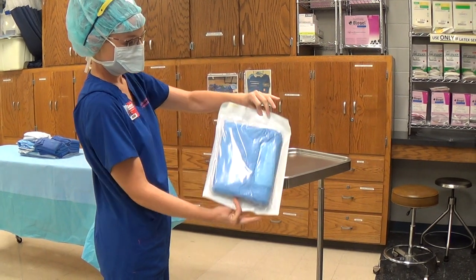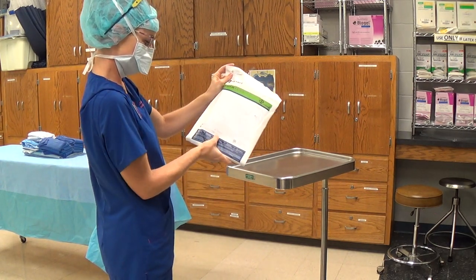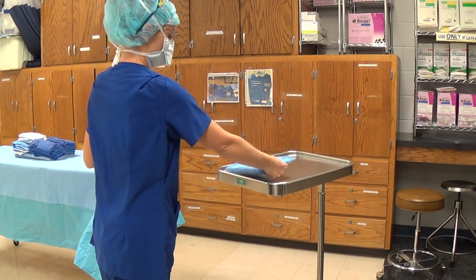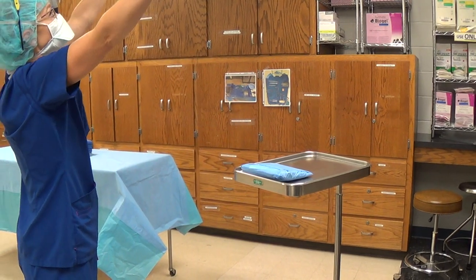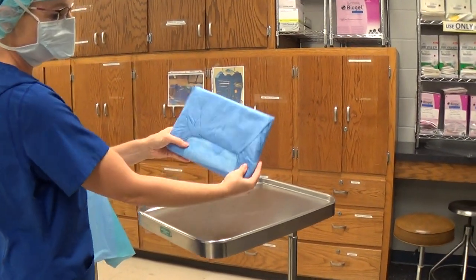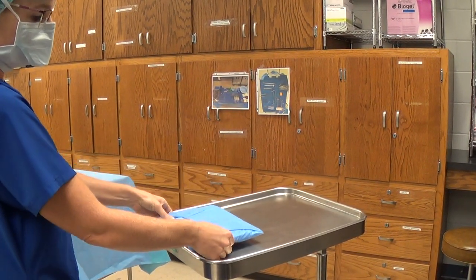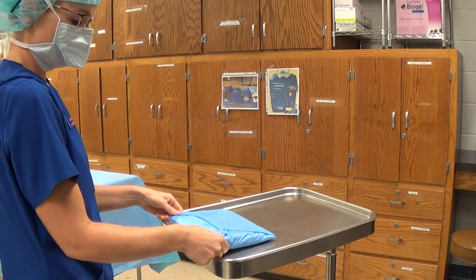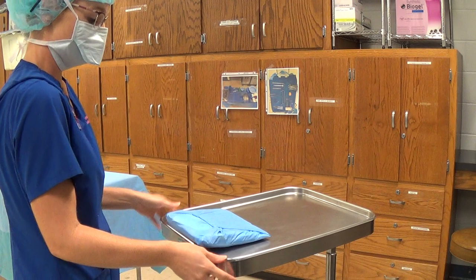She has her dust cover on her gown. She's checking it for holes, checking the expiration date, making sure it's good before she opens it. This is something you can just pull out because the gown is envelope wrapped. She's going to check her cover, holding it up to the light for holes. Looks like her wrapper is good. Remember, these have a lot of memory, so she's checking the gown, setting it down so that the first corner is sticking out towards her so that when she opens it the first flap will be away. She's placed the mayo in the center of the mayo stand, towards the front edge, not in the very center.